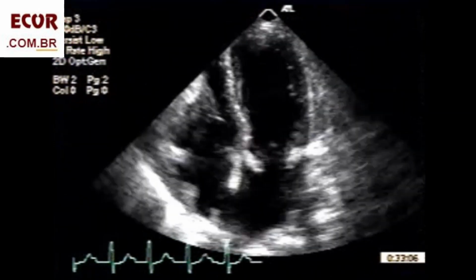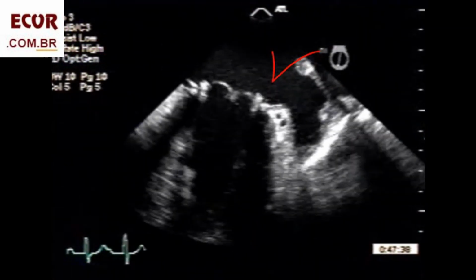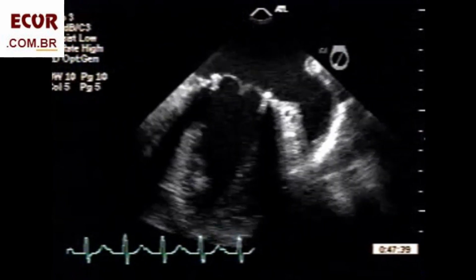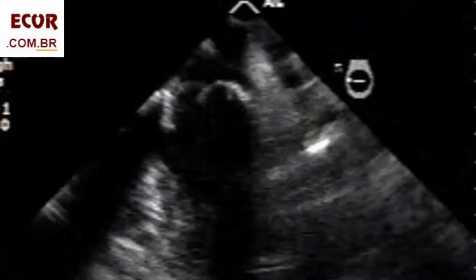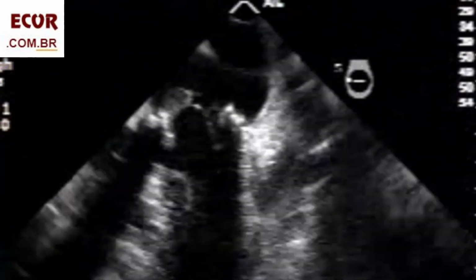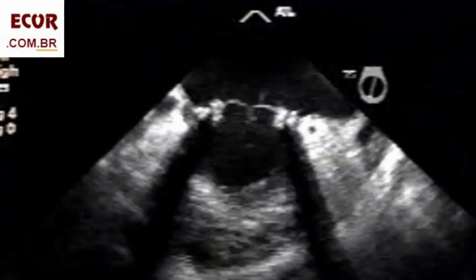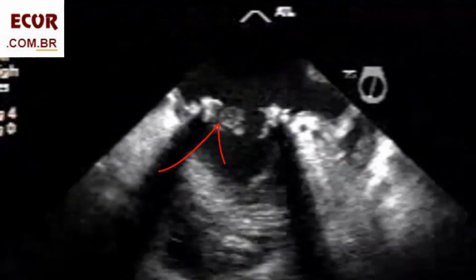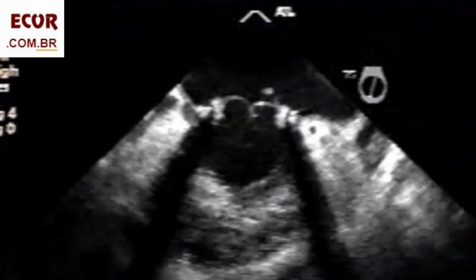In this apical 4-chamber view, the prosthetic seems to be okay. TEE of the same patient shows a mobile structure right here and a certain thickening of the leaflet. This thickening of the leaflet is better demonstrated here with mobile structure. At first view, this may be a thrombus, but we cannot rule out vegetation of endocarditis. The probability is greater for vegetation since there is this filiform structure moving, and not only a possible vegetation in the ventricular side of the valve, but also in the atrial side that may look at a possible abscess.